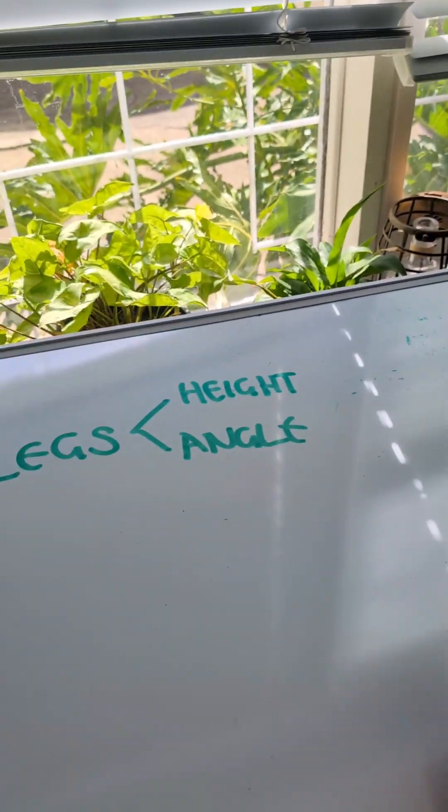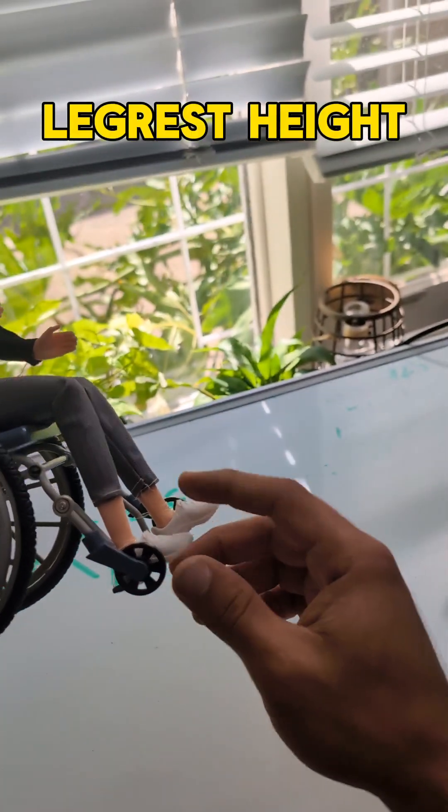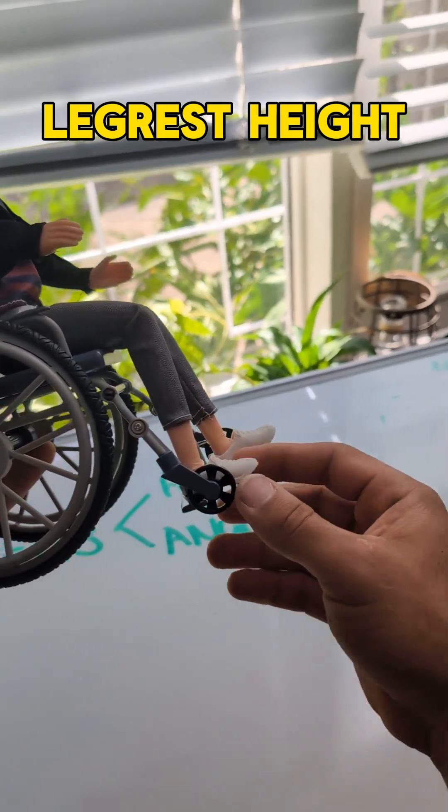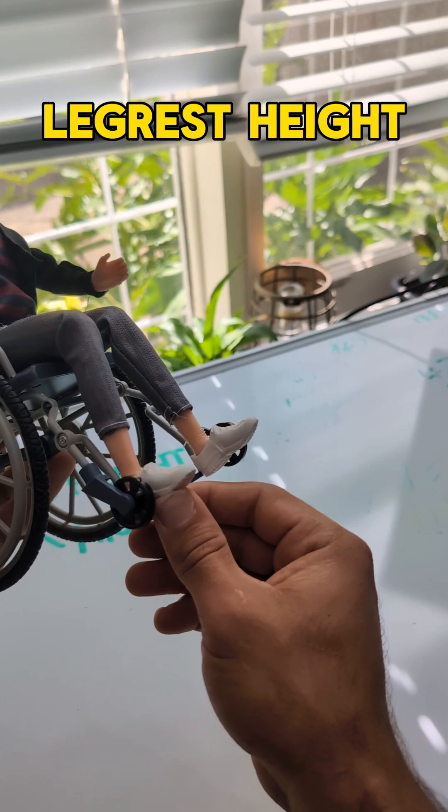Another thing you want to look at is the leg rest, both in the height and the angle. If the foot plates are too low, there's nothing really pushing the client back into the chair. The client's going to slide forward until they make contact with the foot plate.